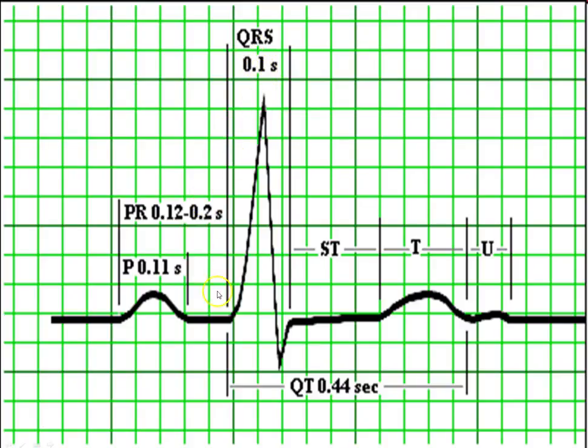The QRS complex, again, is measured from the first upward deflection to when it's back to that isoelectric line, and I haven't mentioned that yet, but we'll get to it. The ST segment is that period from the S wave here to the T wave that begins as the upslope there. It's a long bump there. Remember that was when the ventricles are repolarizing, and the U wave, if it's present, is back there at the end. The whole QT interval is measured there.